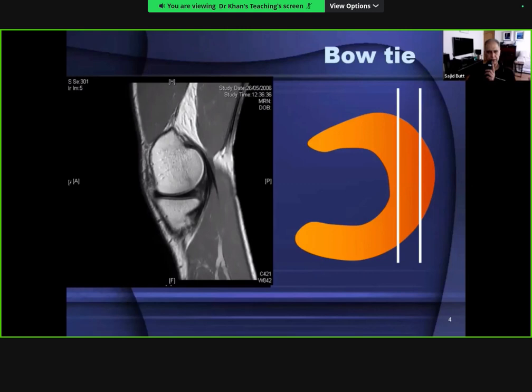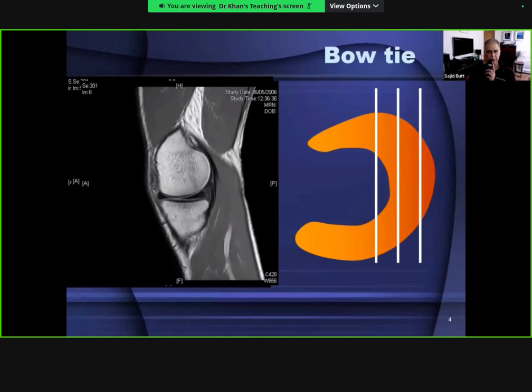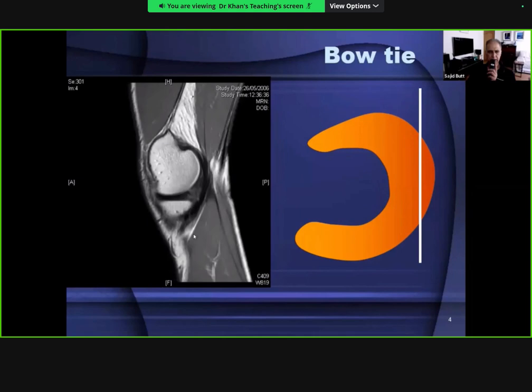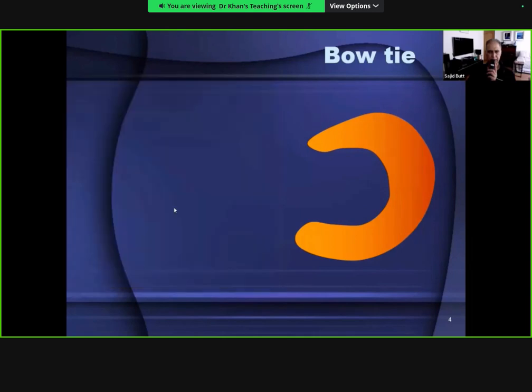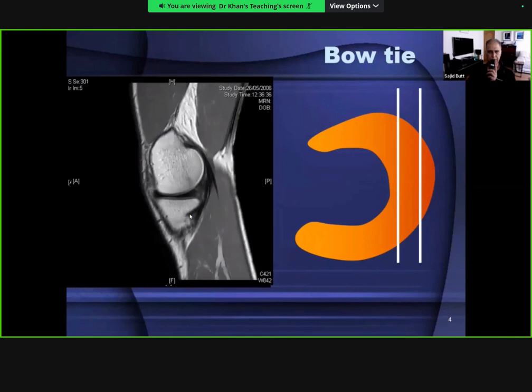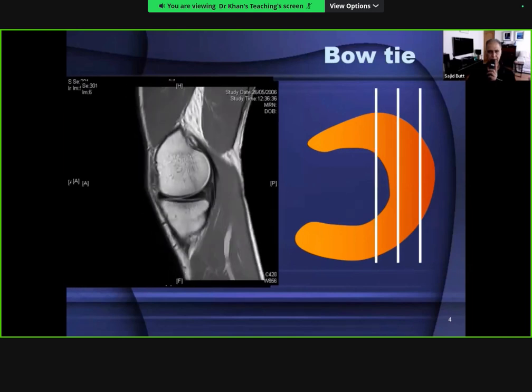As you move further towards the central side of the knee, the bow tie shape continues - a larger posterior horn and smaller anterior horn, which is the classical appearance of a normal medial meniscus. Going further centrally, the two segments of the bow tie appear separated by the space between the meniscus. If you do not see the bow tie on at least two consecutive slices, you may be dealing with a possible meniscal tear, with significantly attenuated meniscal tissue and a degenerative tear.